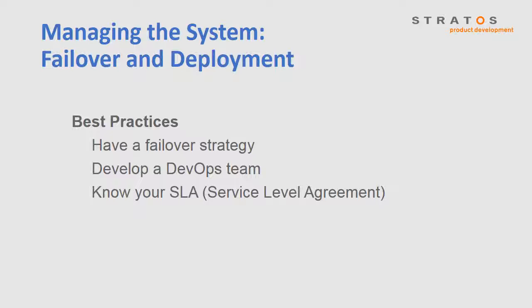Though it might be tempting to add DevOps late in the project, remember that cloud systems are not launch and leave software. Your DevOps team will support your cloud-connected medical device system as long as it is deployed. If you bring them in early, they will provide crucial insights and requirements in support of deploying, monitoring, and controlling your solution. This wraps up our discussion of the example patient monitoring system. Let's review some of the things that we've covered.